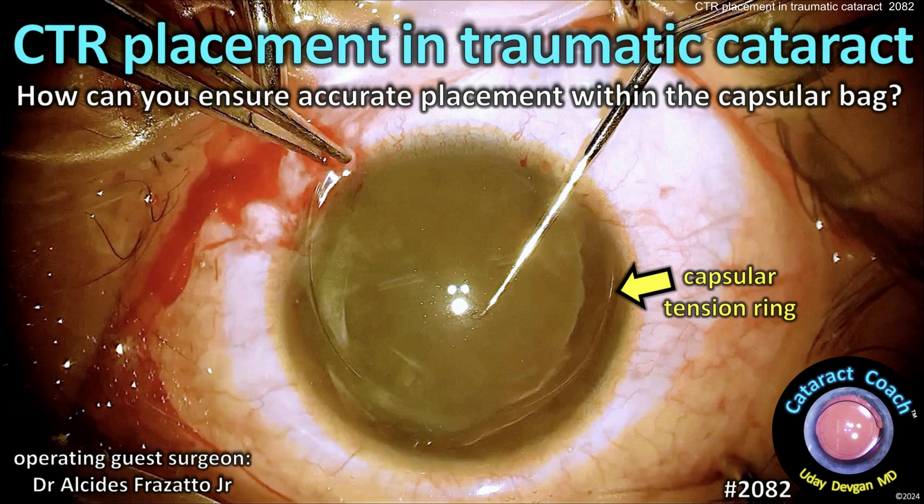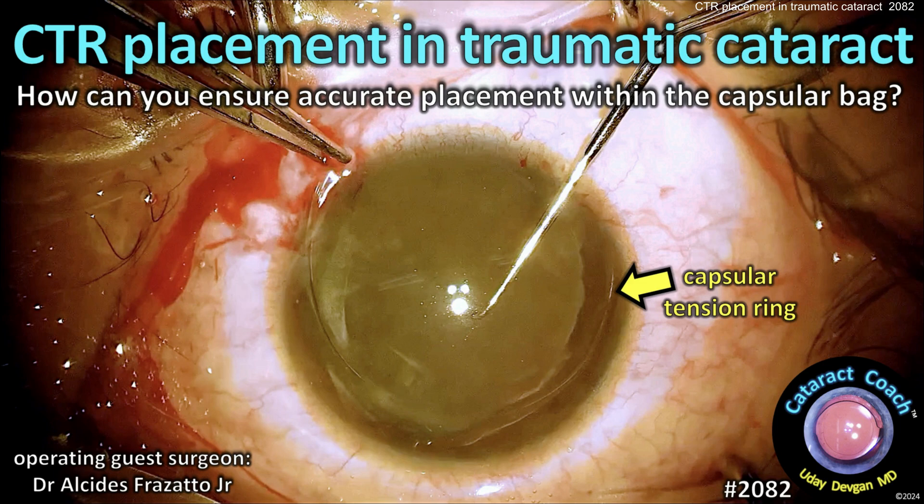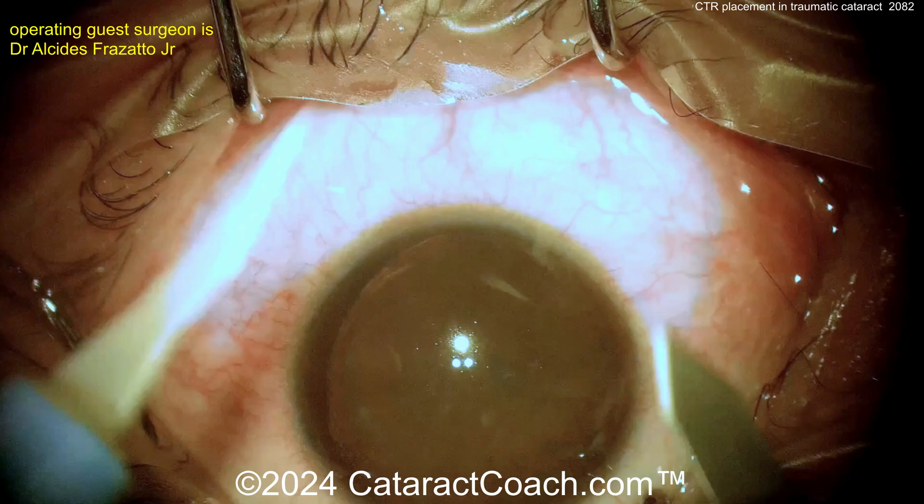CataractCoach.com. CTR placement in traumatic cataracts — how can you ensure accurate placement within the capsular bag?